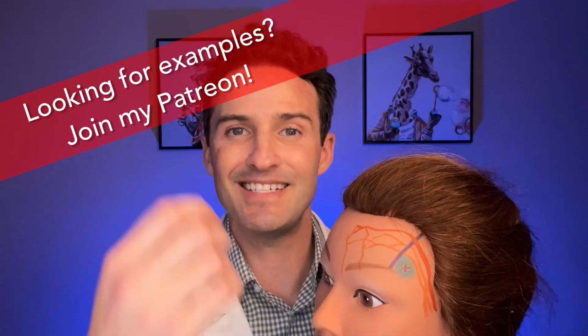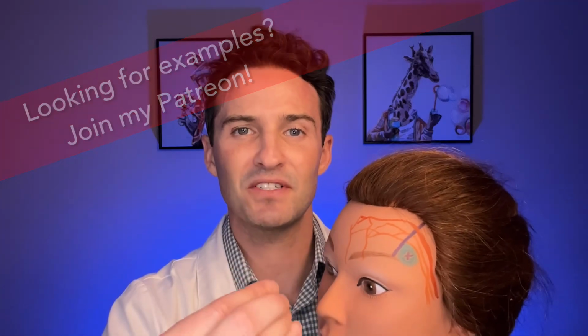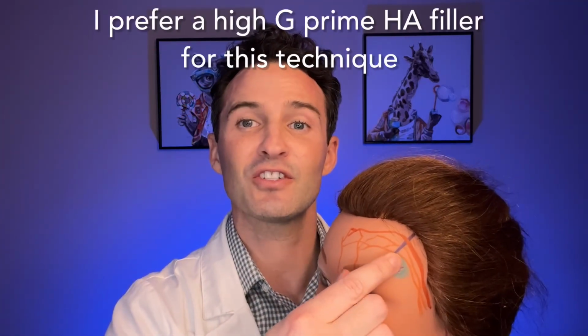So if I'm going deep with a lot of resistance, against the muscle, and I'm using a stiff product, good luck trying to push this down. You can say you have the intention of doing that, but likely it's probably just going to stay here.